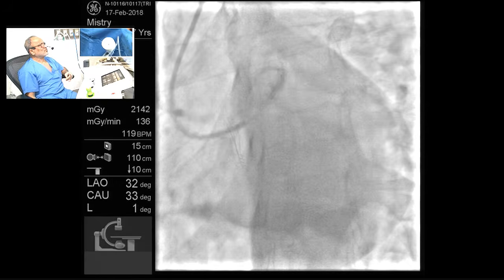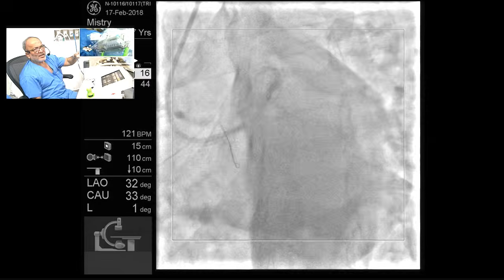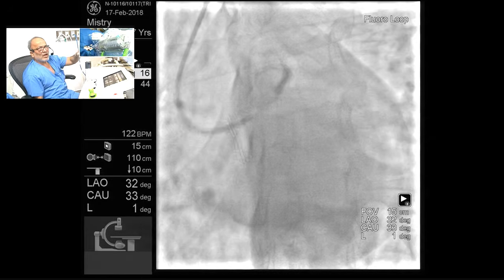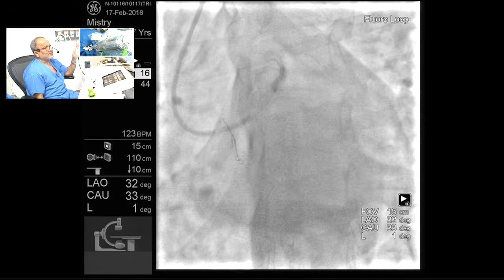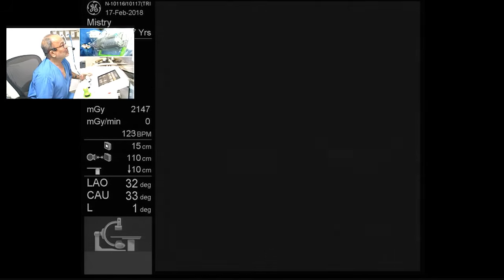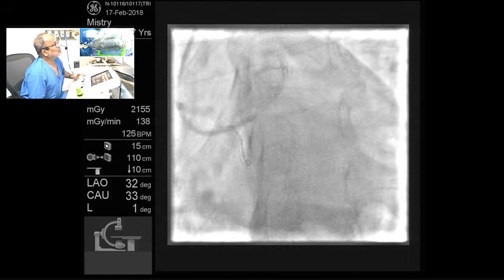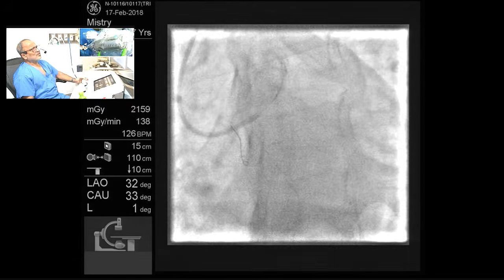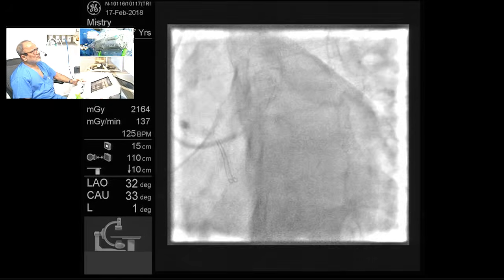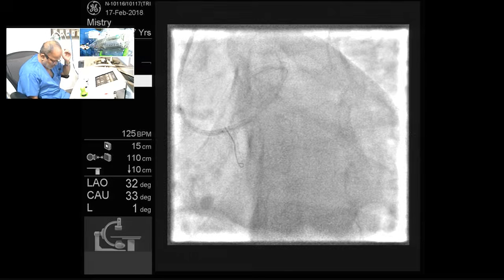10, come down. There is an ectasia. So if I am dilating it with a bigger diameter balloon, I will be careful, I will not go very high. Come down. What do you think about advancing the balloon a bit more and proximal optimization because of that angulation, so that the second stent goes in smoother hopefully? Pardon? Proximally optimize this first stent with a higher pressure. Let us see. Record.